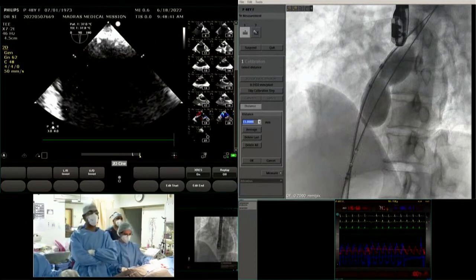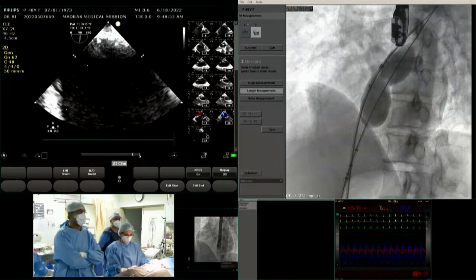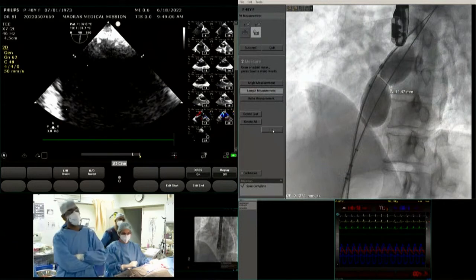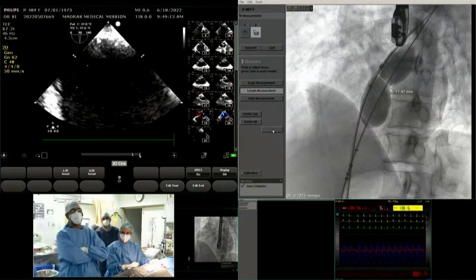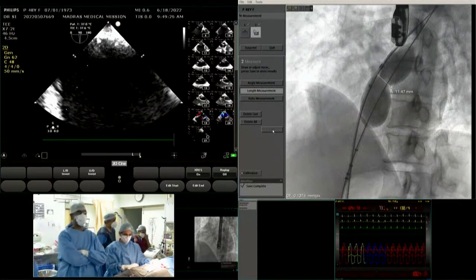There are a few patients who have turned out very, very big. For example, where we measured 18 millimeter on echo and finally we ended up putting a 30 device. In fact, in a couple of patients, in that article we have described a patient who was having a 20 millimeter hole, we decided to put in a 26 millimeter device. The 26 millimeter device embolizes, but on balloon sizing, the balloon stretched diameter was 28. So we decided that we will go more by the echocardiogram and add plus 6, but that was not adequate. So finally the embolized device had to be retrieved and then we upsized it to 30 millimeter. So what we decided was to use balloon in every patient with a double ASD.